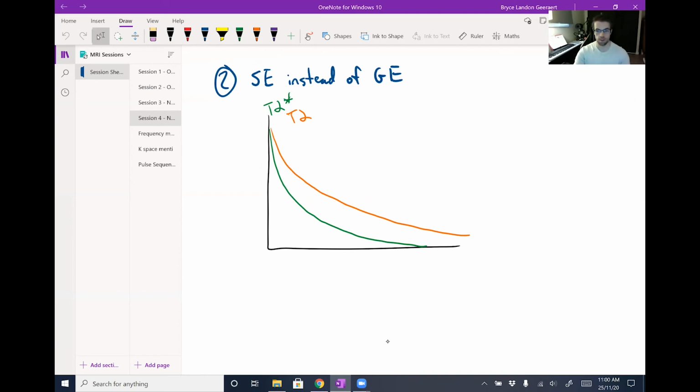Okay, final 3 questions. What happens if we increase our slice thickness? In that case, signal to noise ratio will increase. This is for the same reason as our voxel size question at the very start. We are now recording signal from more spins, right? And we're essentially just increasing the size of each individual voxel by modifying the height of that voxel, the Z height, the slice thickness. So we're recording information from more spins, which means we're recording more actual signal, which can kind of outweigh the noise. So SNR increases when we increase slice thickness.